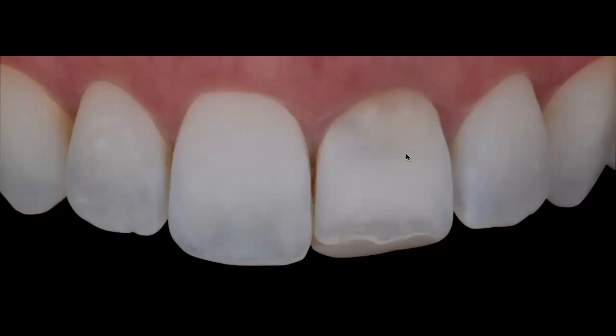All these materials now have created that halo, that transparency or translucency effect in that cervical area that now differ from that very high value white cervical third seen on tooth number 8, and that's what we have to try to replicate. So right there, I can tell you that I'm most likely going to have to place a very thin, opaque dentin in that area so that I can hide or mask that area.